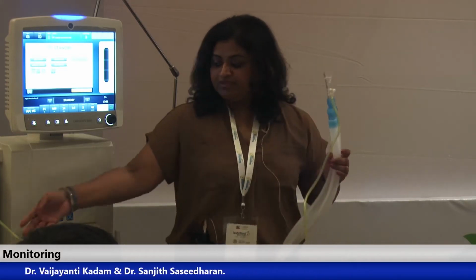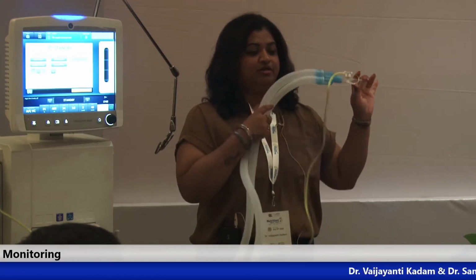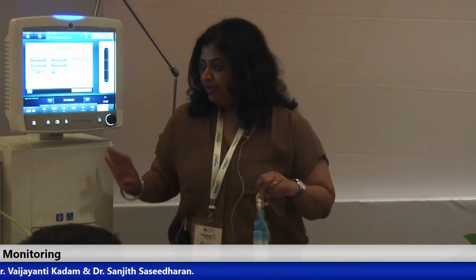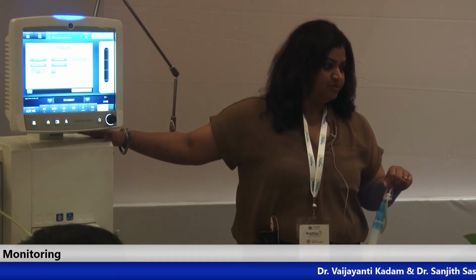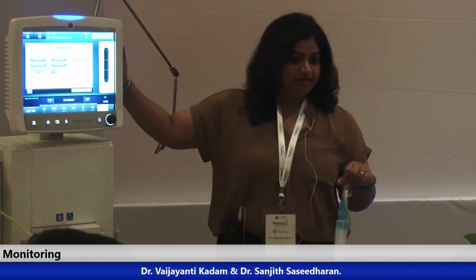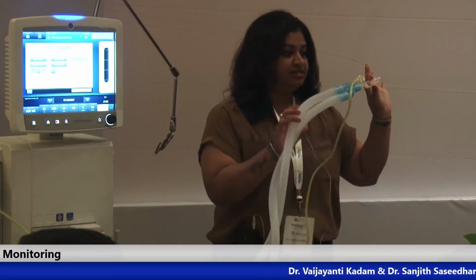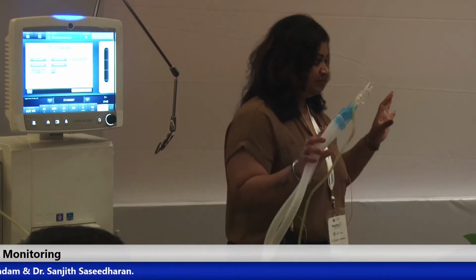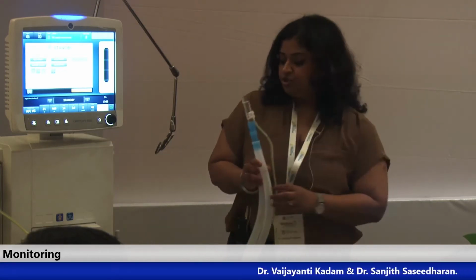Once this is attached, we have to make sure that we do not disconnect this patient for a while. When this machine is started, it first has to calibrate itself. We need to calibrate this machine, and that will take around 10-15 minutes. Once it gets calibrated and we connect this, there is a warm up time for this machine. The warm up time is somewhere near 30 minutes. Only after 30 minutes it will start showing the results.